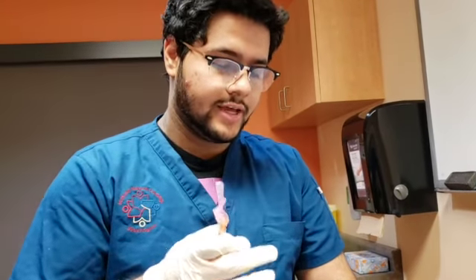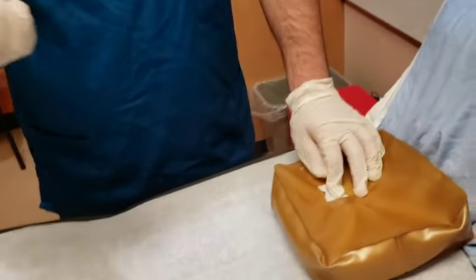And we're gonna take our alcohol swab, place it, pop the safety back on, and now we're just gonna hold it for a minute or two just to make sure that the medication doesn't come out of the injection hole and that there's no excessive bleeding. And after we've held it for a couple of minutes, we're gonna throw this in a sharps container and then dispose of the alcohol swab accordingly.